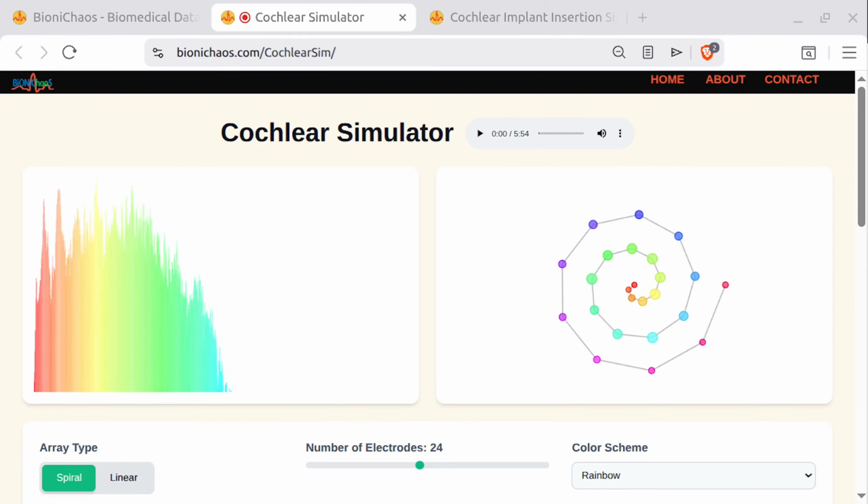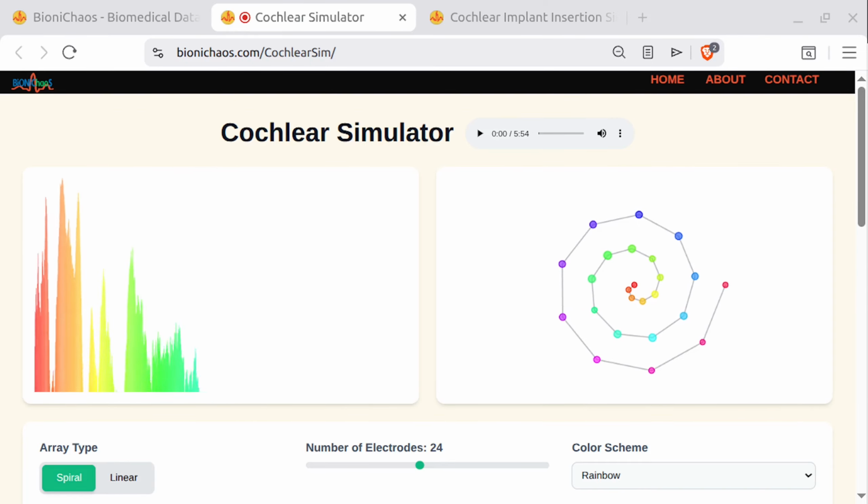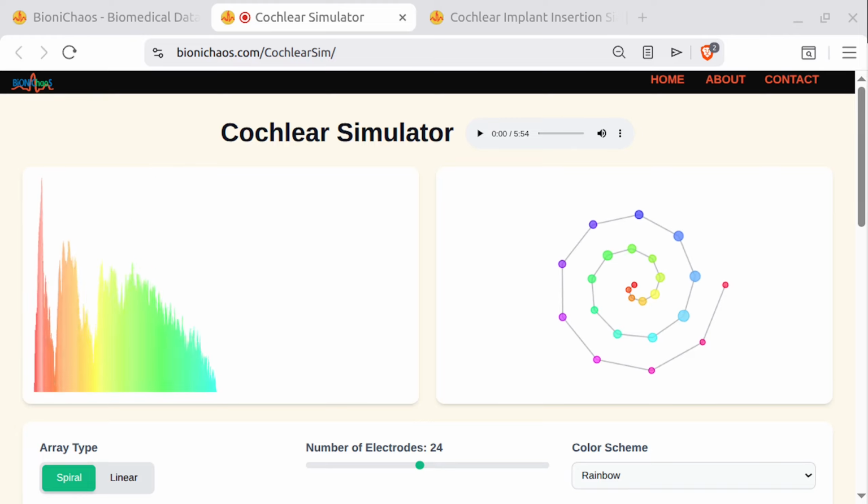And we haven't even touched on the collateral damage to the vestibular system yet. The balance center? Right. The inner ear isn't just for hearing, it's our body's spirit level. Right next to the hearing organ is the saccule, a tiny fluid-filled sac lined with hair cells that tells your brain which way is up and senses gravity. Anatomy 101, yes. Well, when you thread a foreign electrode into the scala tympani, the fluid channel of the cochlea, you physically displace the fluid and risk bumping that delicate sac. Up to 75% of patients experience some form of vestibular impairment or vertigo post-surgery.